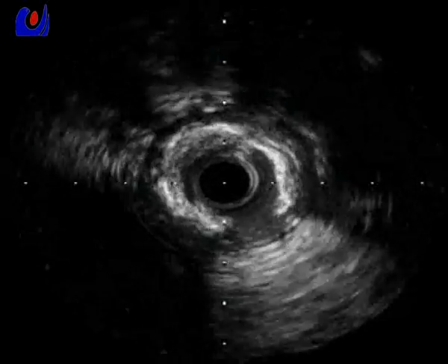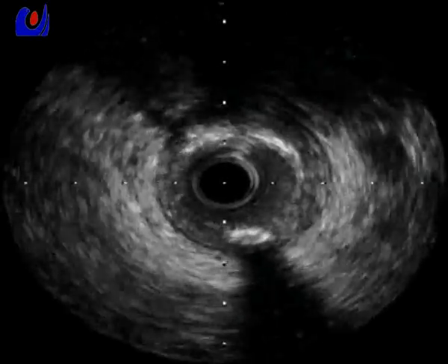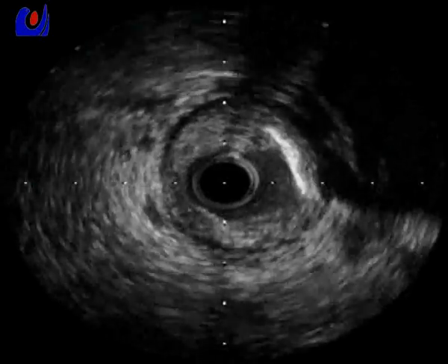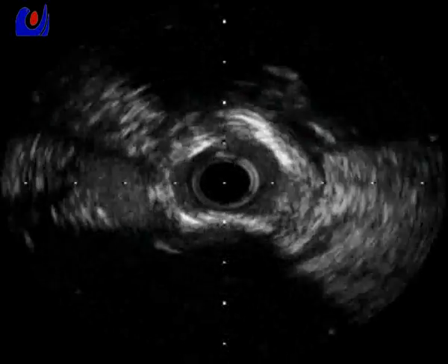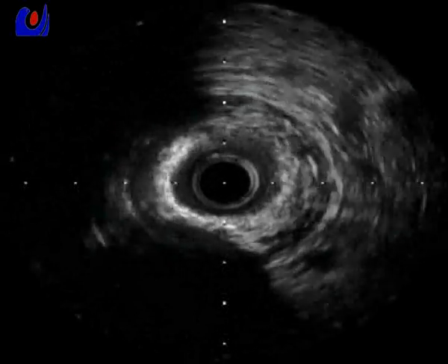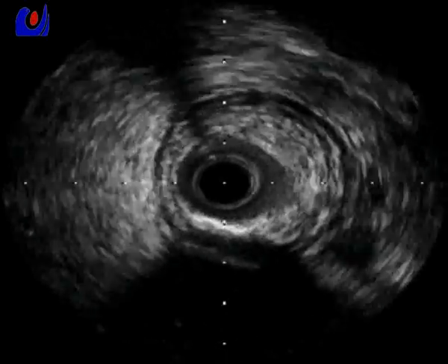So we have a lot of calcification. A patient on dialysis usually has a very calcified lesion. But this lady is good. We can see only 90 degrees of calcification. And now this is more severely calcified, but we can see that even the calcium line has been split by our high pressure inflation with the 2.5.